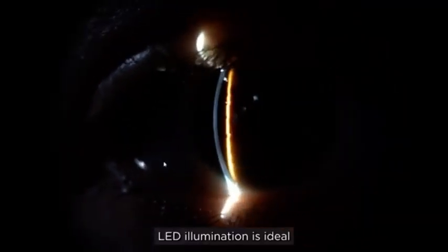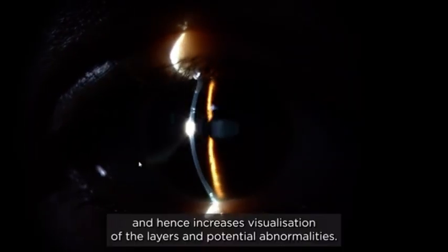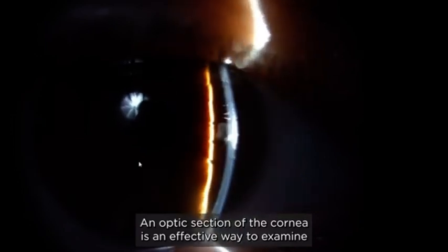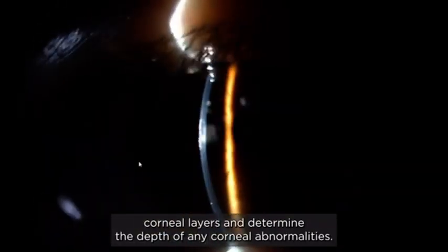LED illumination is ideal because it maximizes the scattering of light by these structures, and hence increases visualization of the layers and potential abnormalities. An optic section of the cornea is an effective way to examine corneal layers and determine the depth of any corneal abnormalities.